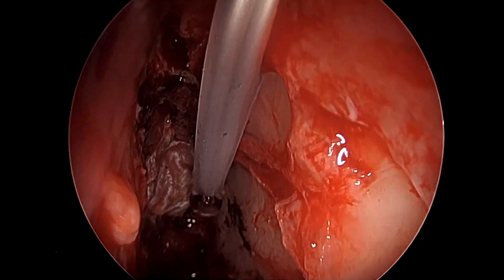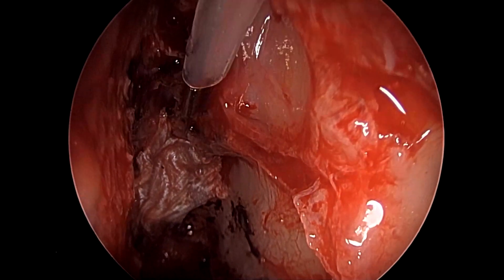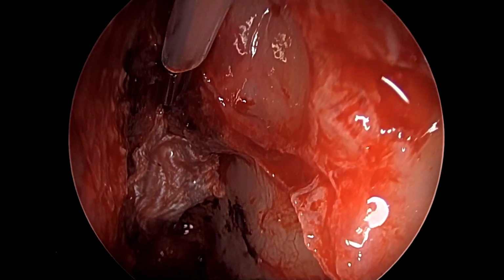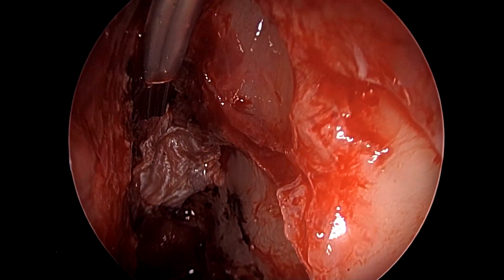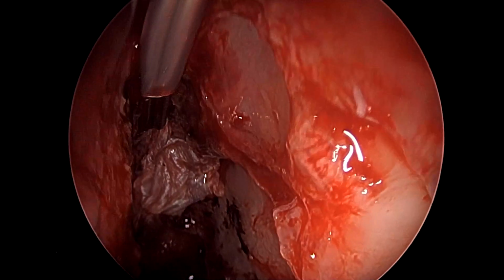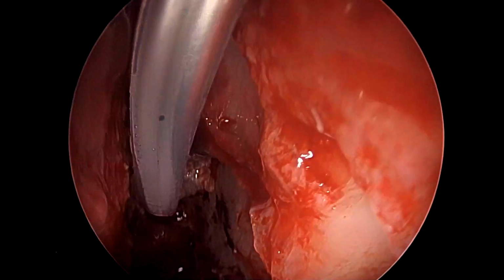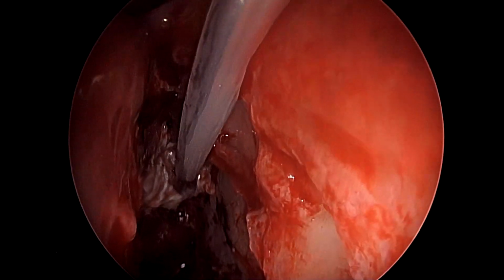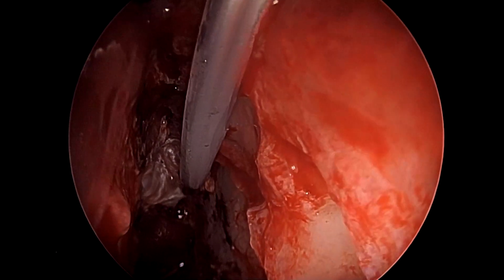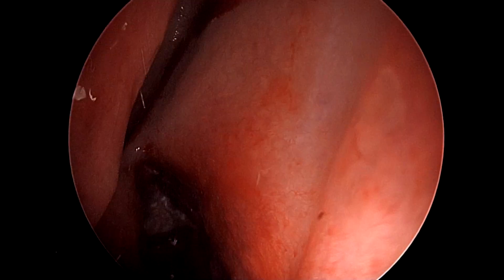So whether we use 1 layer, 2 layers or 3 layers in skull-base reconstruction, we strongly recommend that all these layers be used one upon the other without any glue in between, and glue be used only in the end on the final layer, whether it is a free mucosal graft on the middle turbinate or the fascia graft. We always recommend that it be used at the end on the final graft material and not in between the various graft materials, because that could lead to failure.